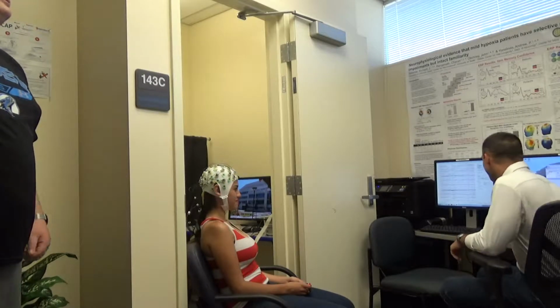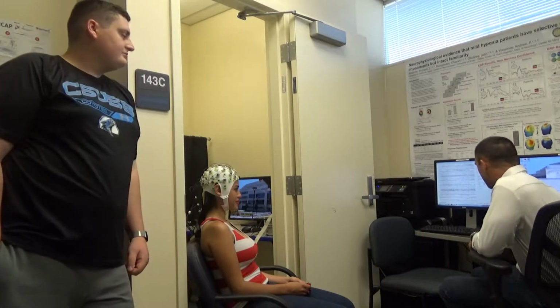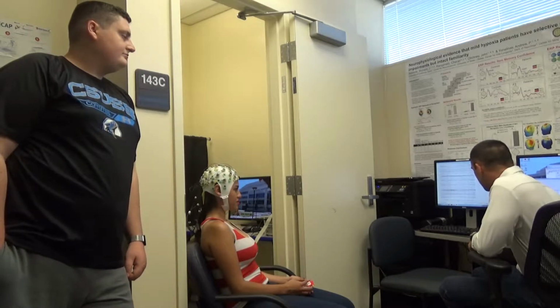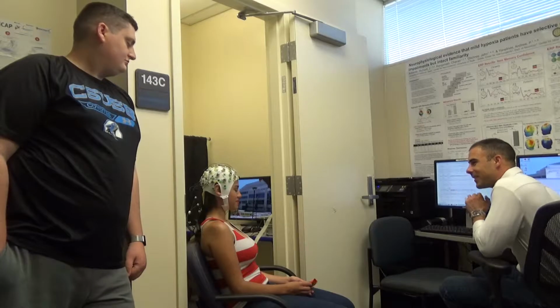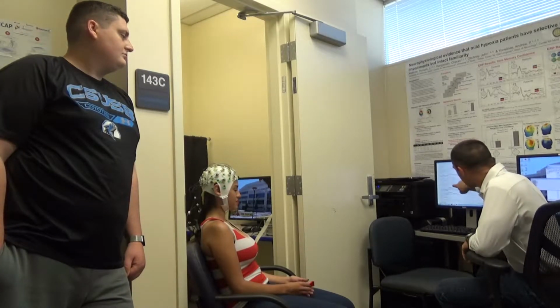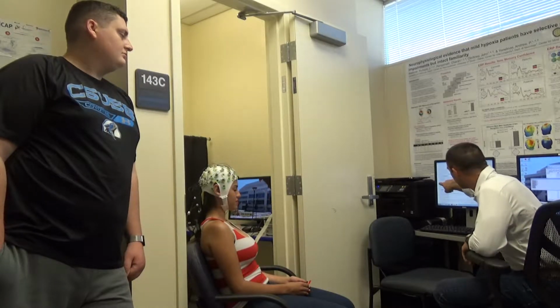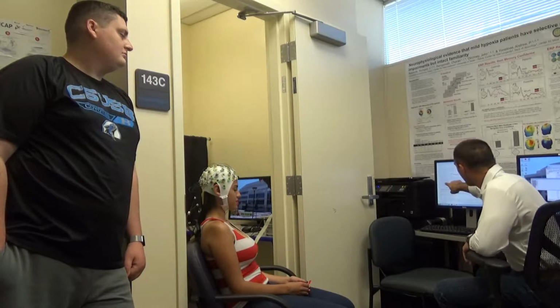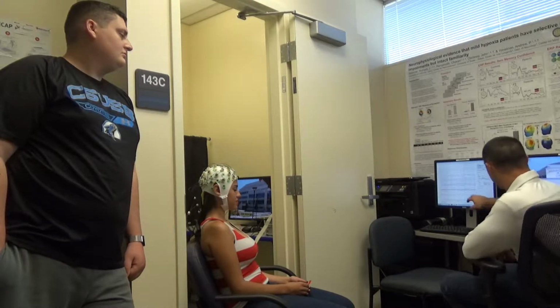So we have Nelly's brain activity happening here. And the first thing we can do is just ask her to close her eyes. Alright, so she closes her eyes and we start to see right off the bat these alpha patterns of frequency at these occipital sites, right? OZ, O1, O2, all these spots you get these low frequency oscillations. You guys see where that happened?